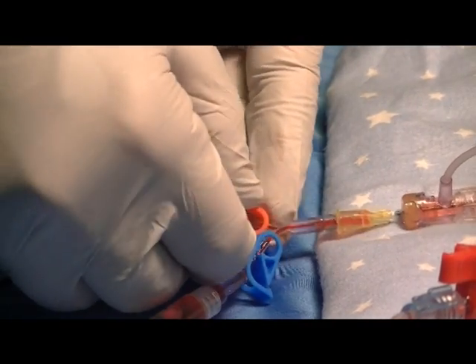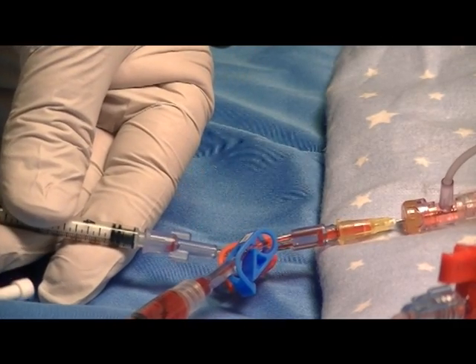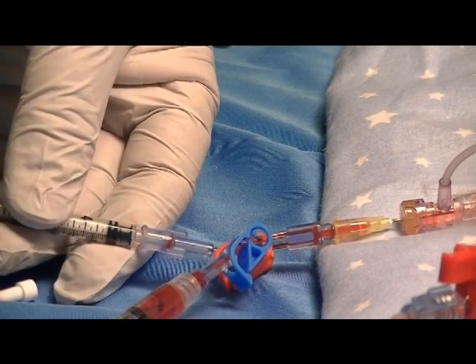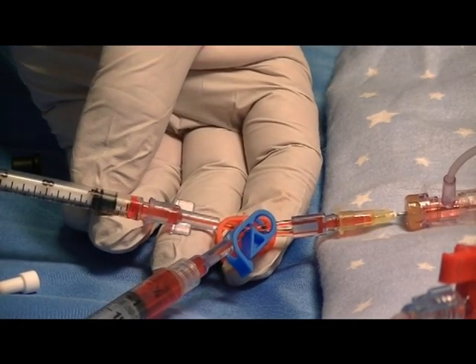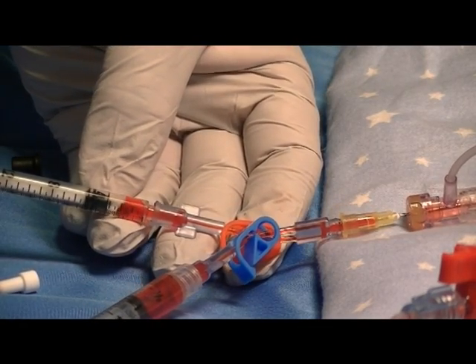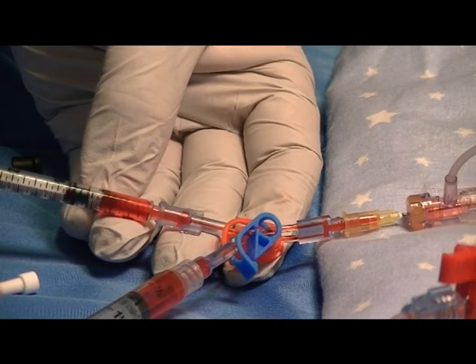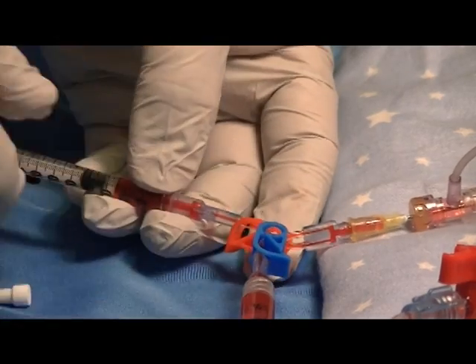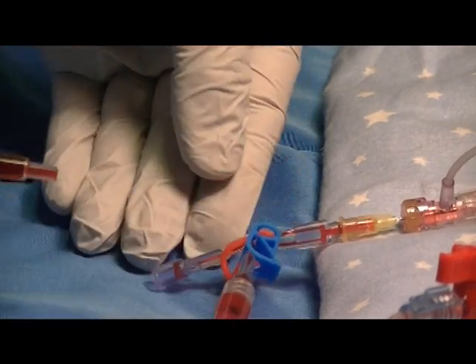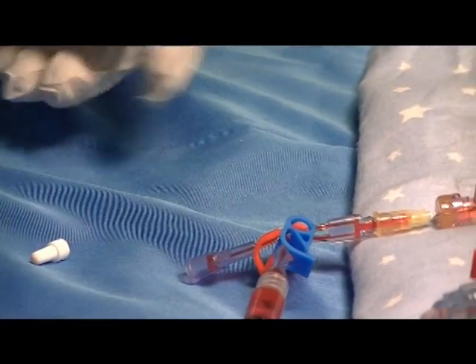Unclamp and draw the desired volume of blood into the syringe. At that point, re-clamp and remove the sample syringe cap and send it for testing.